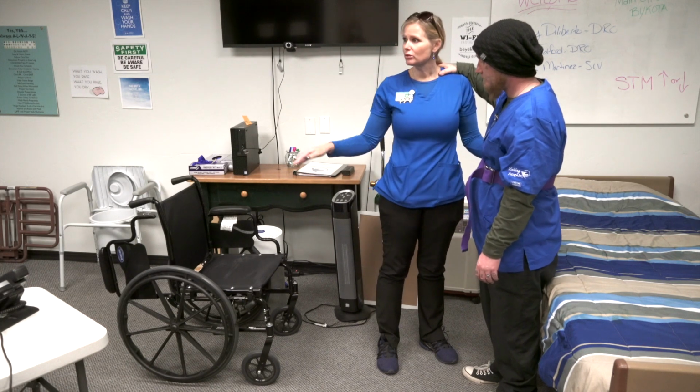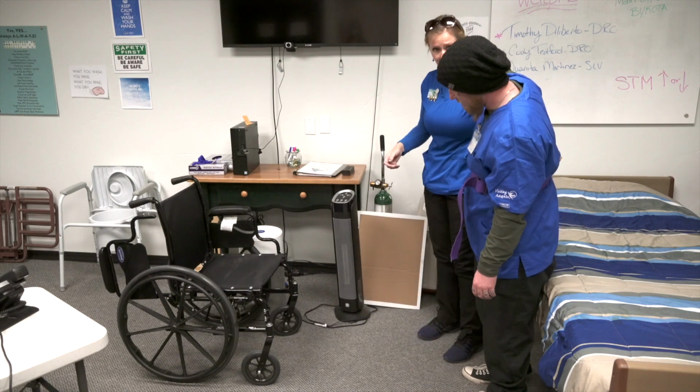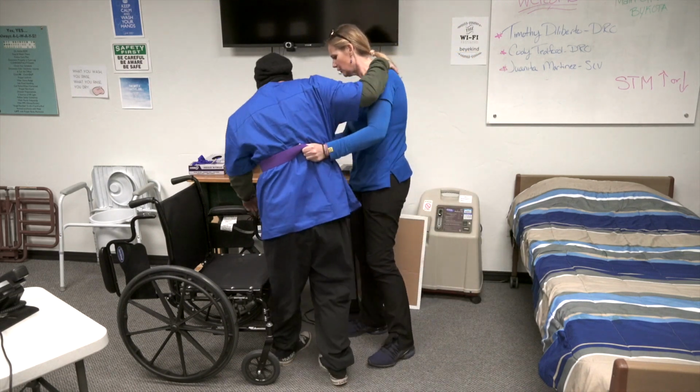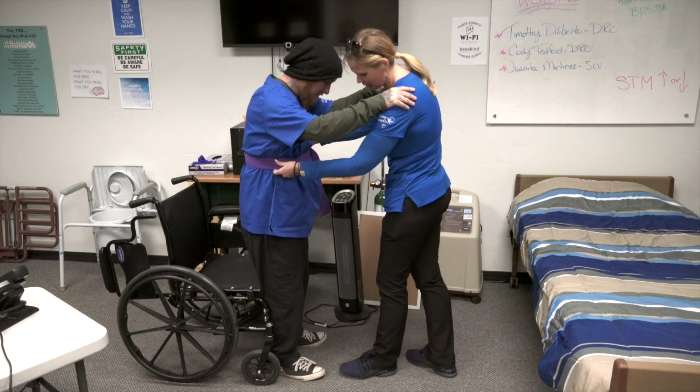Now, if the couch or the recliner is a little far away, what you can do is you can actually turn this way and hold on to the gait belt from the back and have them walk that way. So Cody, let's go walk to the couch. Okay, good. Now stop. Before you start sitting down, I'm gonna need to get in position here.